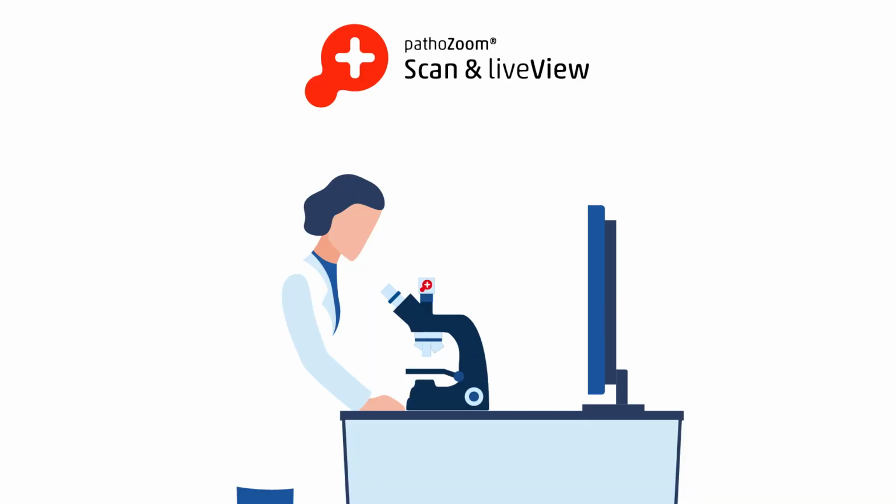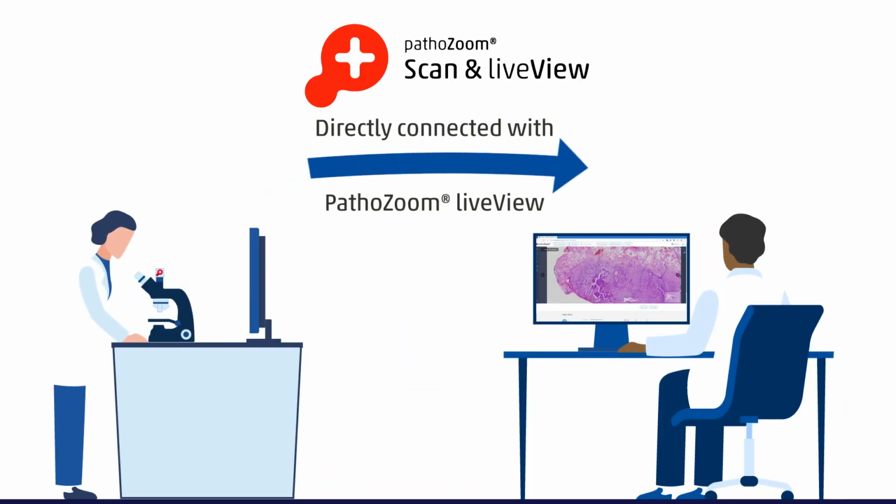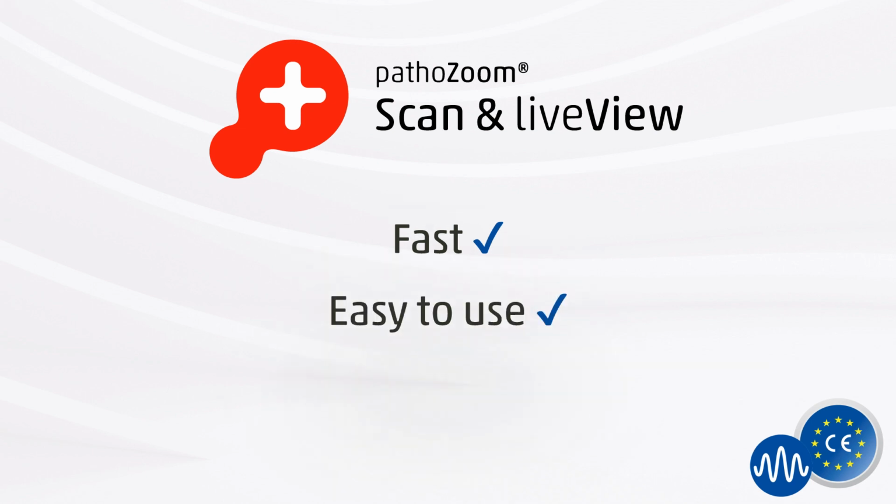You can send a junior pathologist to the frozen section, and he or she can immediately communicate with a senior pathologist who can remain in the office. So you save a lot of time, effort and cost.